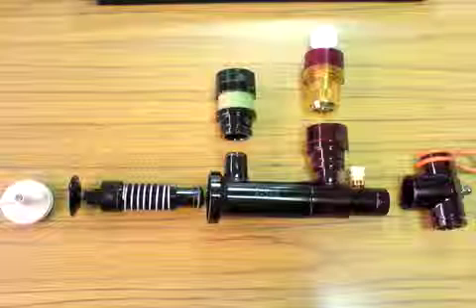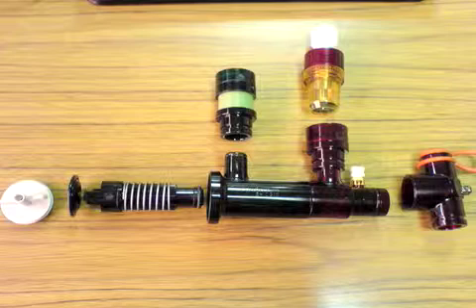In this video we will discuss the proper assembly of the phasotron. When cleaned, the phasotron must be disassembled, therefore you must know how to reassemble it for proper function.